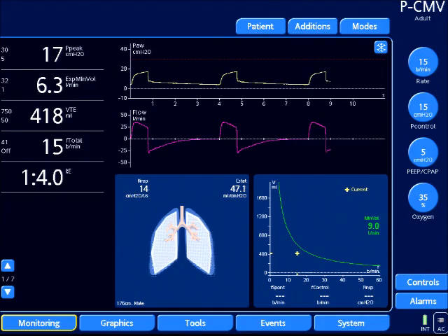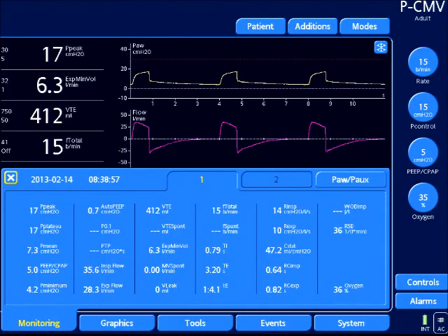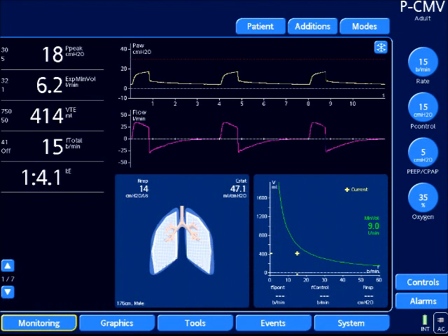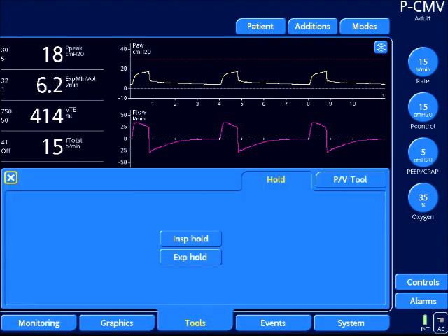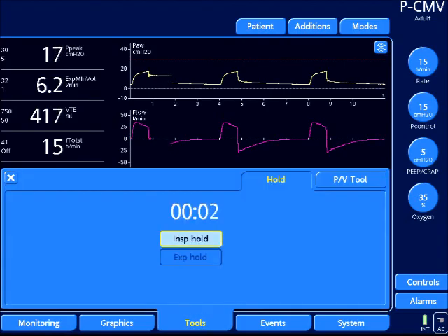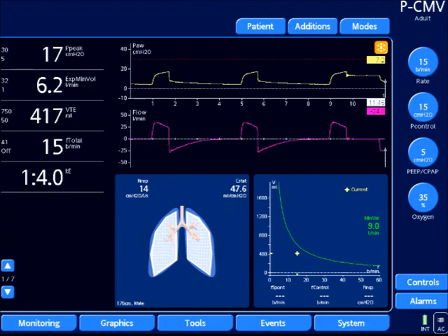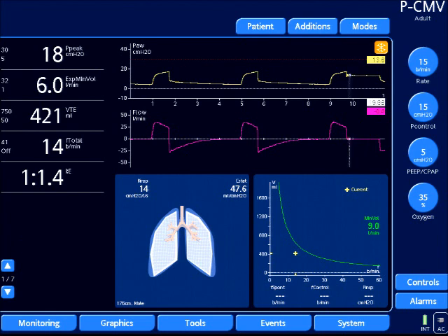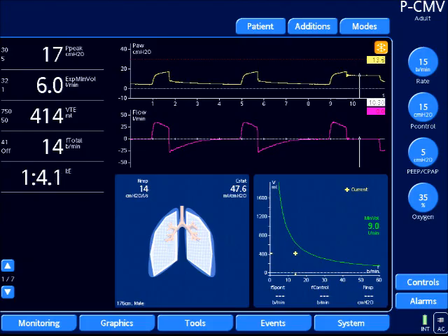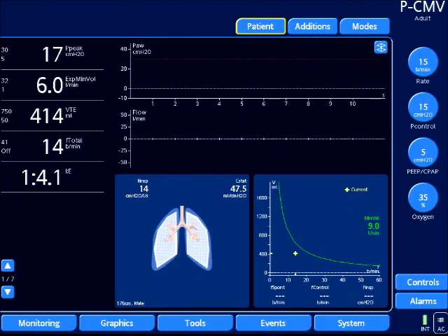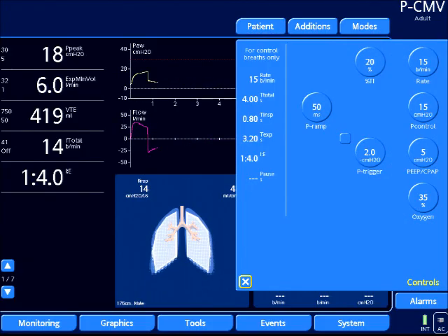Obtaining a plateau pressure in pressure control ventilation: let's look at monitoring first and look at our measured values, which are misleading in pressure control. As you can see, the peak pressure is 17 and the plateau is 17. I know this is false because my inspiratory flow is not returning to baseline. So I'm going to do an inspiratory hold maneuver, and you can see my plateau pressure is quite below my peak inspiratory pressure — so different values; they are not equal, which is a common fallacy.